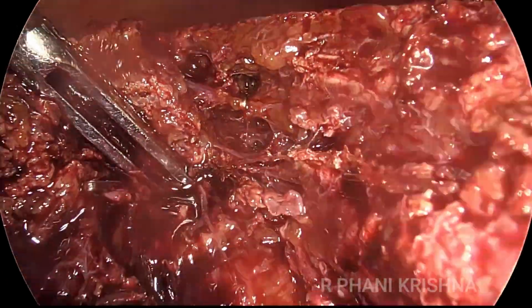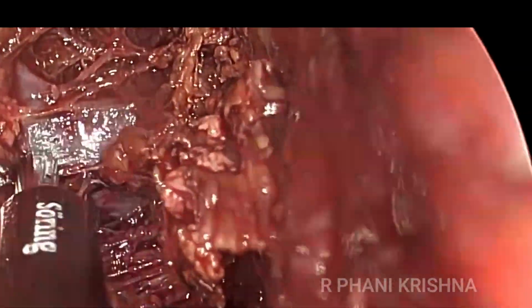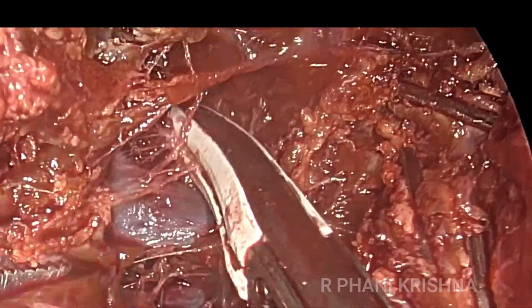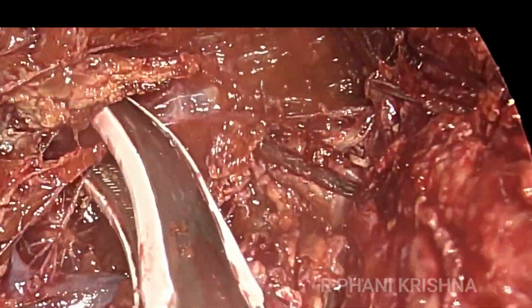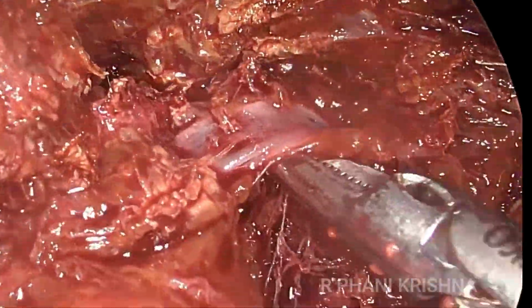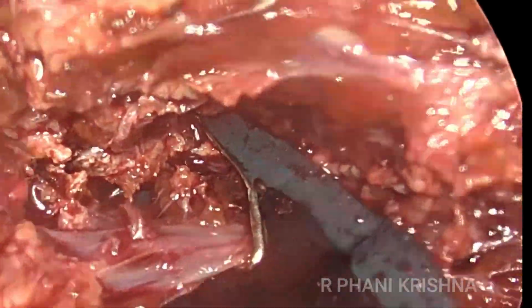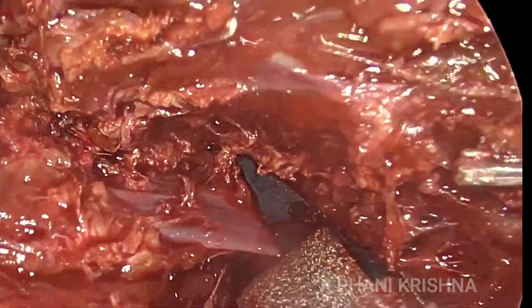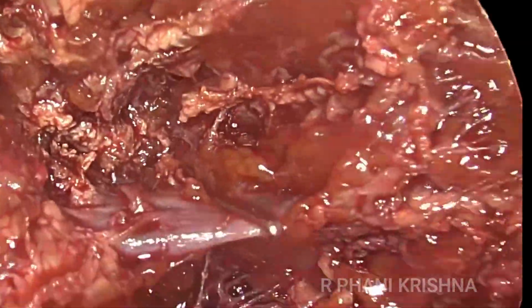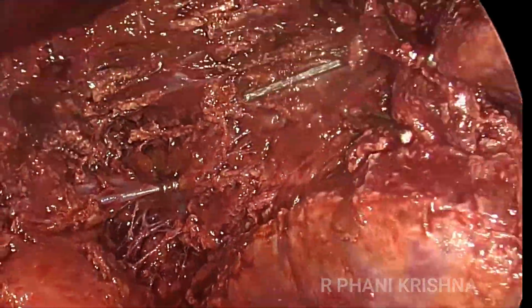As we progress into the superiormost part of this wedge, here you will see the venous pedicles. You can see there, basically you have the segment 4 and segment 5 venous tributaries which go on to form the middle hepatic vein. So these are important anatomical landmarks and structures we need to identify during the wedge resection and segment 4B5 resection, because if we actually injure them, the veins will retract and they can be fairly torrential bleeding from the middle hepatic vein branches.